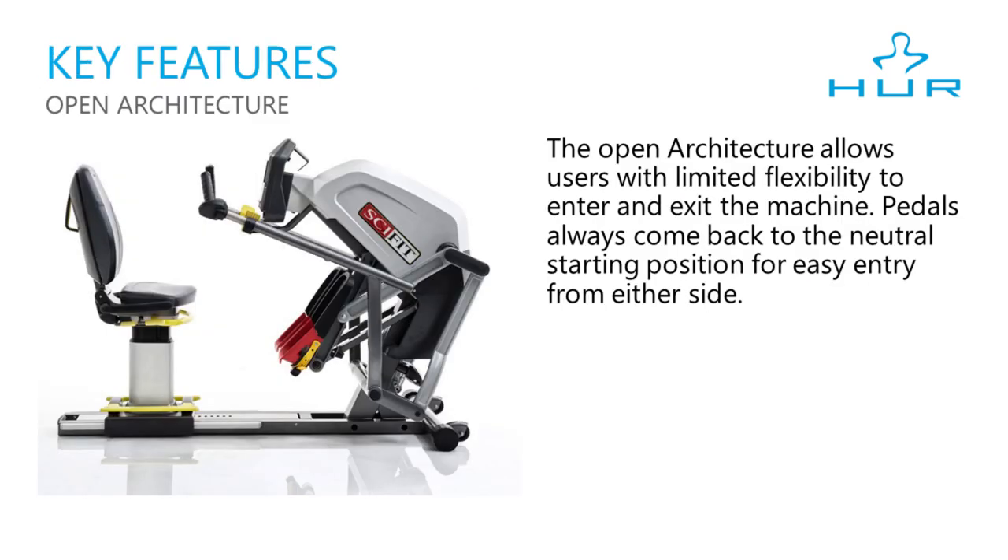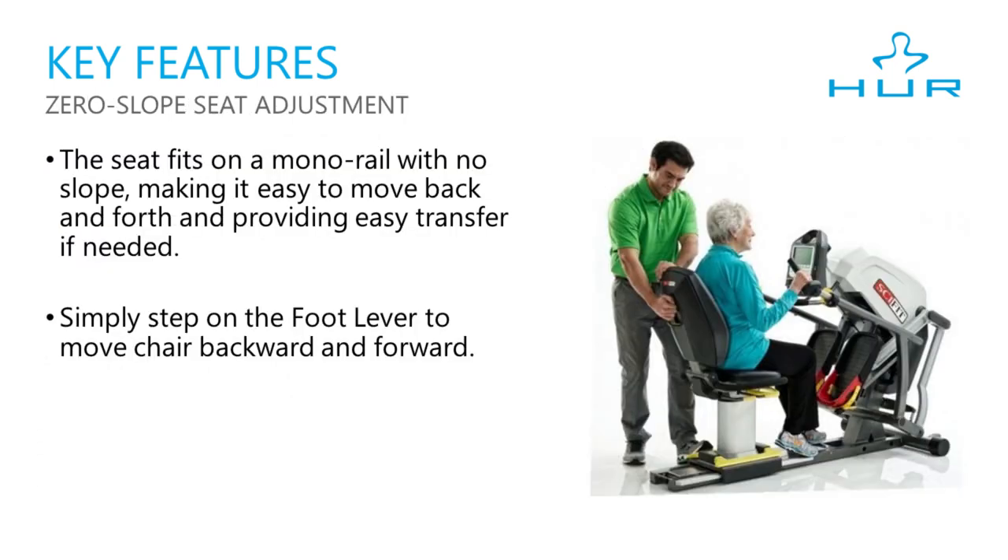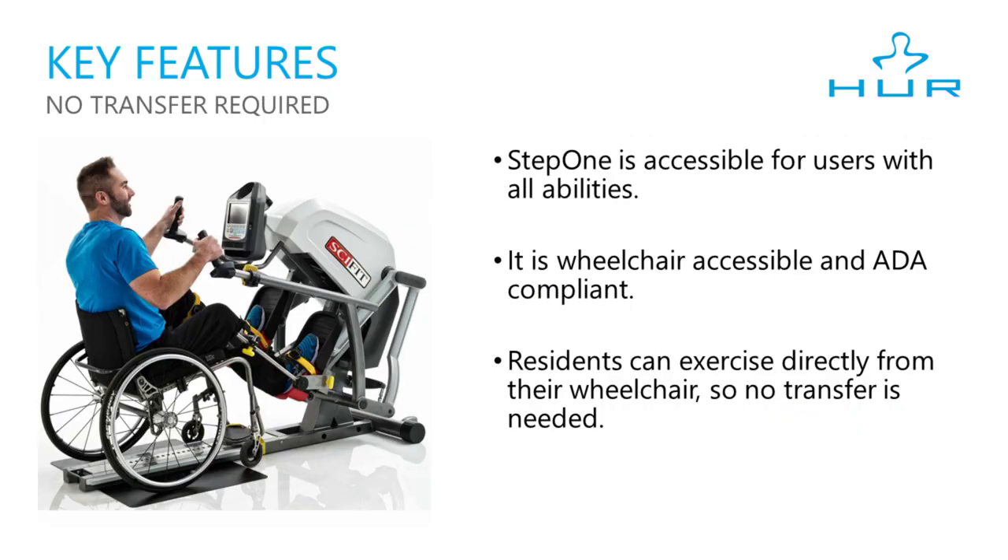The Step 1's open architecture allows users with limited flexibility to enter and exit the machine. The pedals always come back to a neutral starting position for easy entry from either side. The seat slides on a monorail system with zero slope, making it easy to move back and forth and providing easy transfer if needed. You simply step on the yellow foot lever to move the chair backward and forward. You can also slide the chair all the way off, allowing clients to exercise directly from a wheelchair.